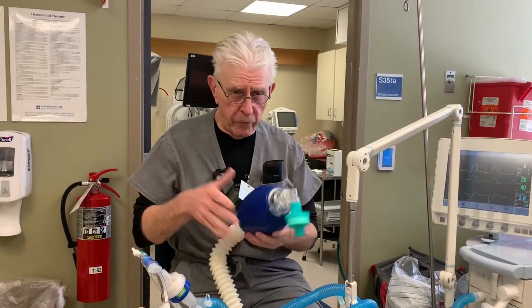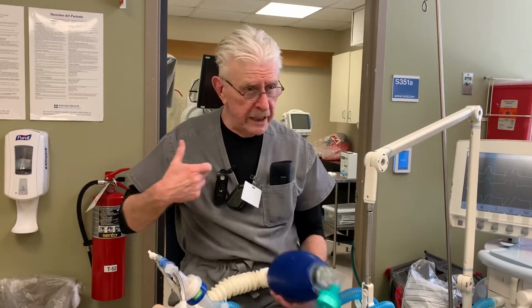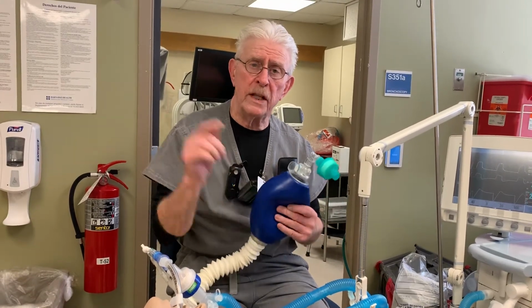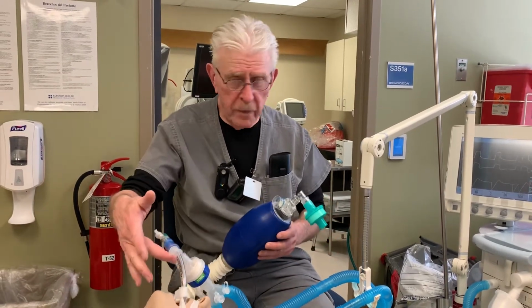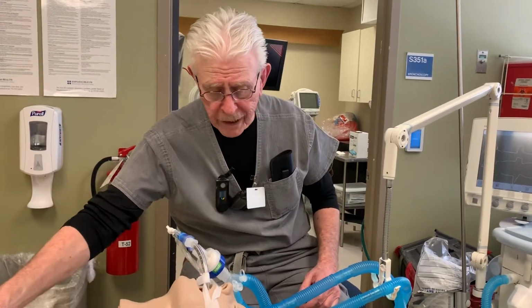There are a variety of ways for us to determine whether or not this tube is in place. One would be listening for bilateral breath sounds. There's another thing that we do not have here, but it's readily available. There'll be one at the bedside for this patient. It's called an end-tidal CO2 detector, for you to determine whether or not there's carbon dioxide coming up through here, which is our verification that the patient is adequately ventilated.